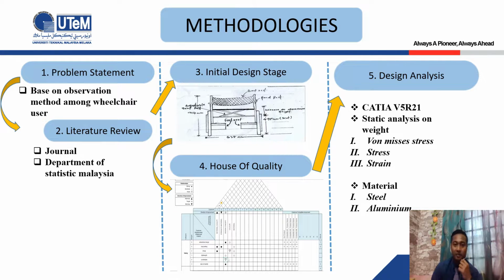Next, methodologies. This is my methodology. First, I have the problem statement based on the observation method among wheelchair users. Next, literature review that has journals and the Department of Statistics Malaysia. Then the initial design stage, House of Quality and design analysis.